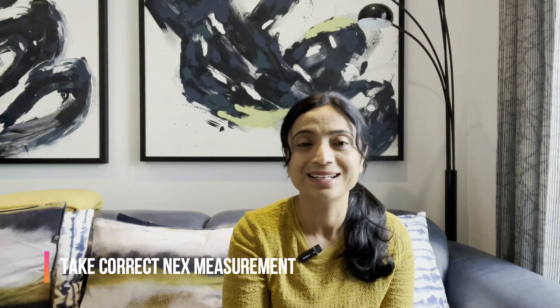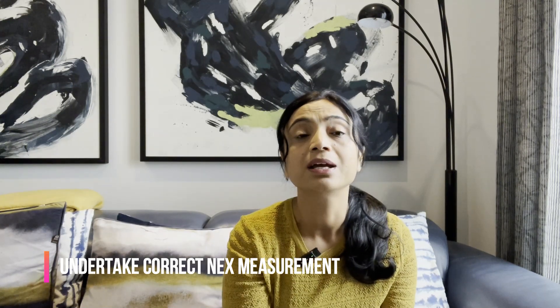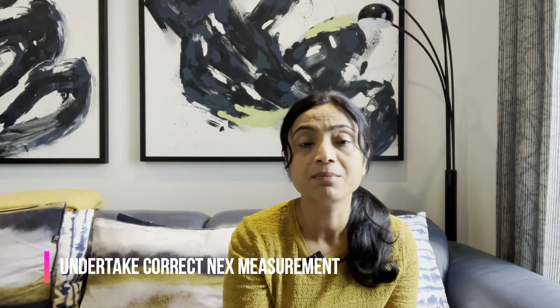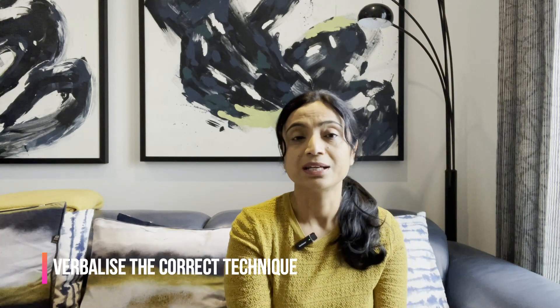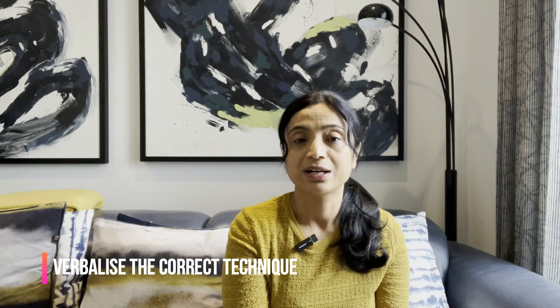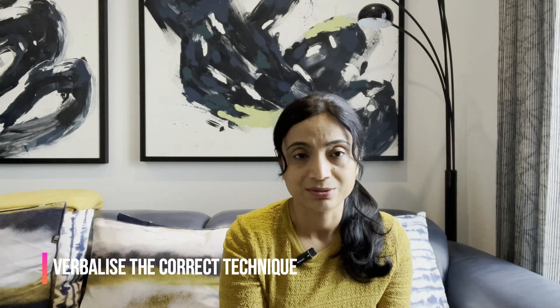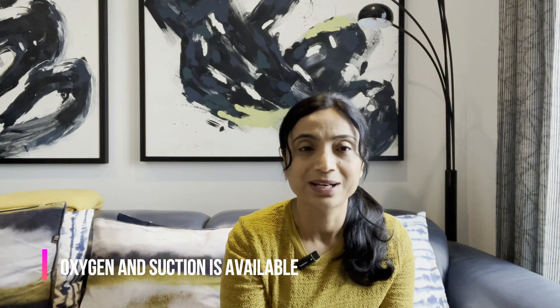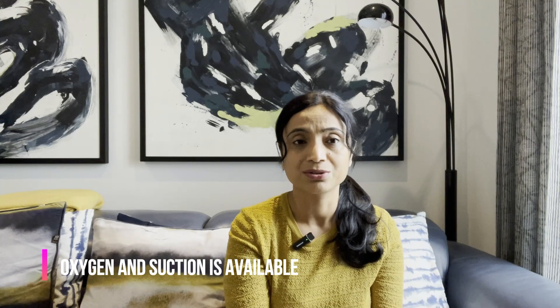Tip three: perform the NEX measurement correctly — from the bridge of the nose to the earlobe (not the top of the ear, just the fleshy earlobe), plus from the earlobe to the xiphisternum. Verbalize this accurately on your mannequin. Tip four: when inserting the tube, verbalize that you are going inwards and backwards along the floor of the nose and that you are continuously watching the patient for signs of breathlessness, coughing, or distress. Tip five: state that you will have working oxygen and suction available — this is a key safety requirement.